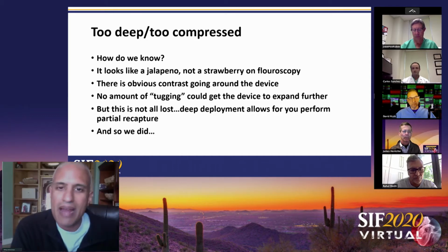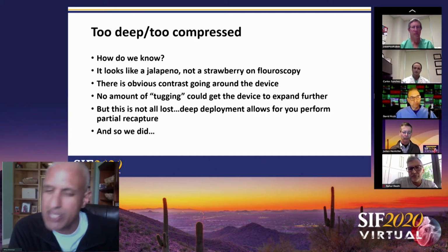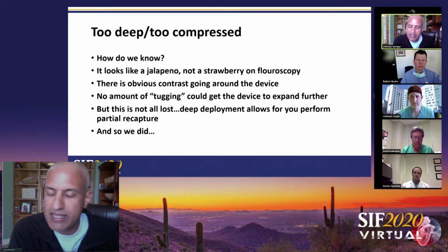You're absolutely right. The tension on my finger, my hands, I think this is the unteachables. I hate to use that phrase. I don't even know if this is a word, but it's something you have to go through to tell someone how much torque or tension to have on the device while you're releasing it. And it's an experience issue.